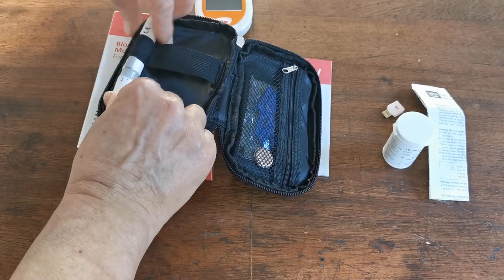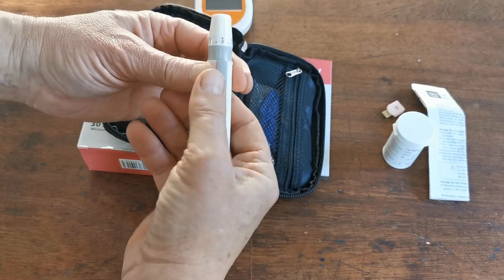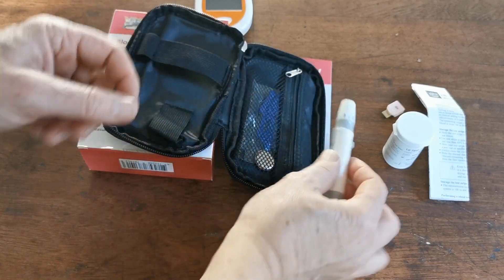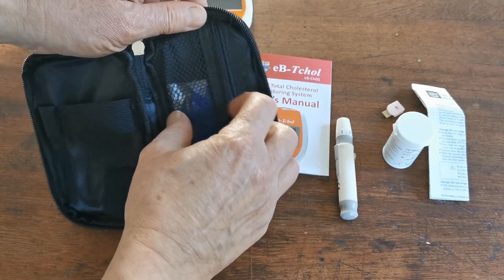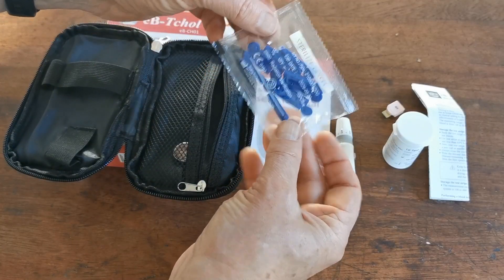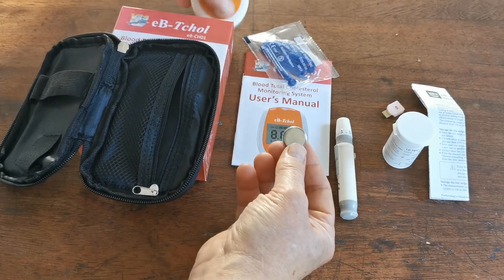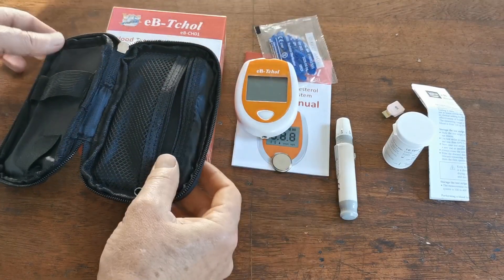It comes in a little vinyl zip case. You get the digital meter, an auto lancing device — this is a spring-loaded lancing device that triggers, and that's for taking your blood samples. Into that go these lancets; you get a pack of 10 supplied with the meter, and you also get the battery for powering up the meter.